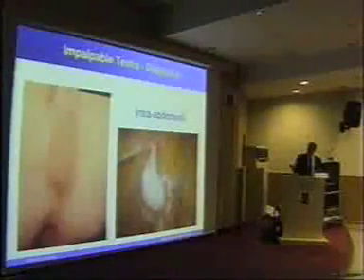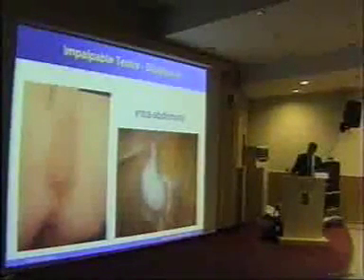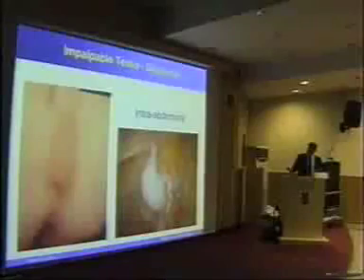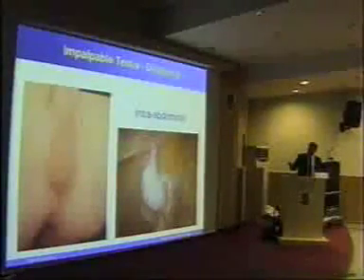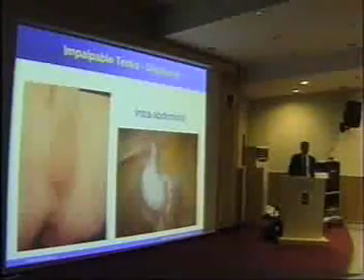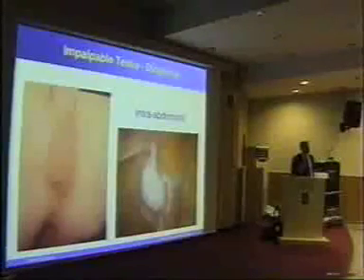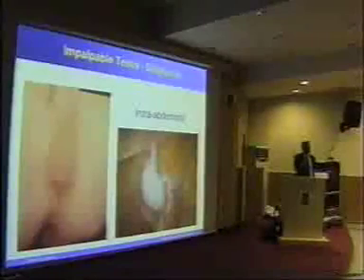Or it may be a truly intra-abdominal testis seen here on the left-hand side, with the vas coming from behind the bladder here, the iliac vessels here, the vessels coming down, and this peeping testis with the internal ring just lying inside. Okay, so we can diagnose what's going on, and a single port laparoscopy is all we need to do. So we can take this group of patients.